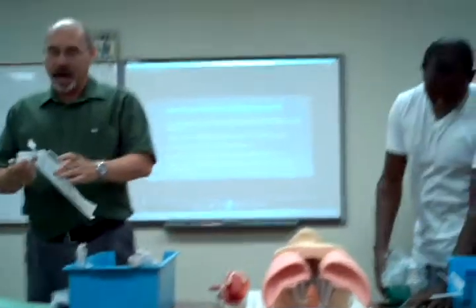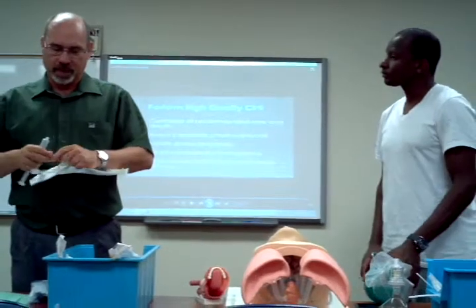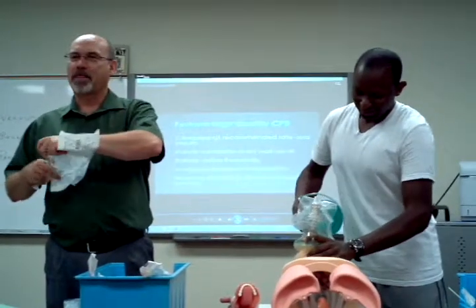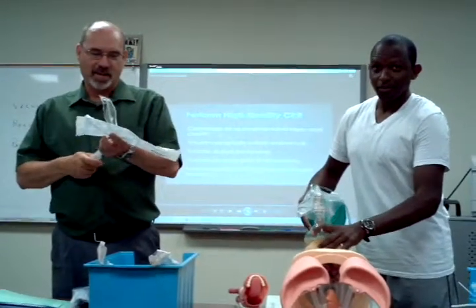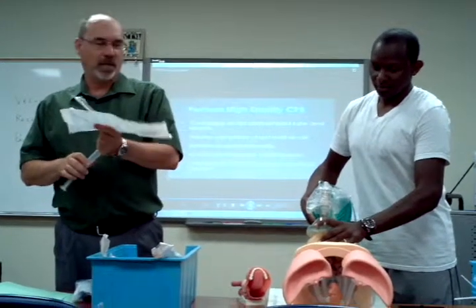So now I have — I hope this one's good since I just opened the package. Are you wearing gloves, Robert? You're not ventilating them. Are you wearing gloves? I'm wearing gloves, I'm wearing goggles. I've washed my hands. I've checked the patient's chart. We do not have a do-not-intubate order.